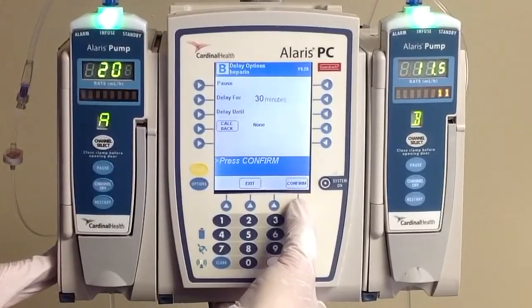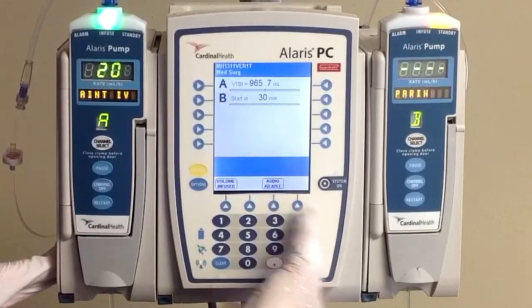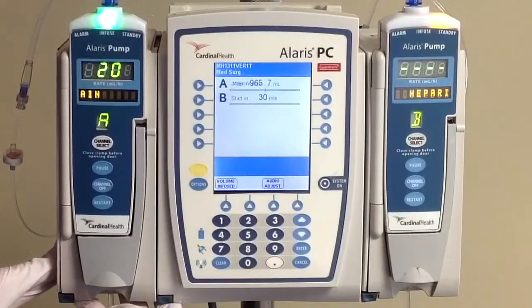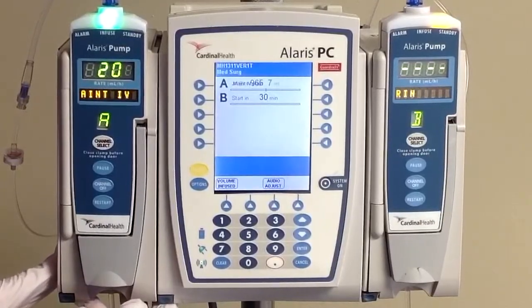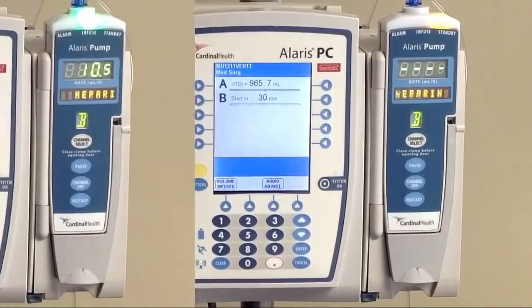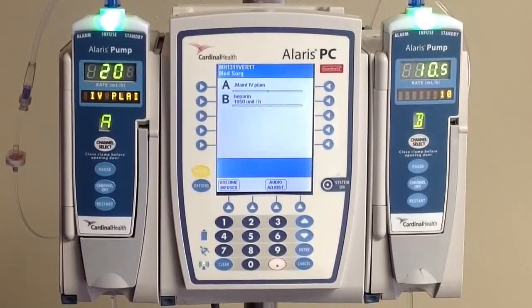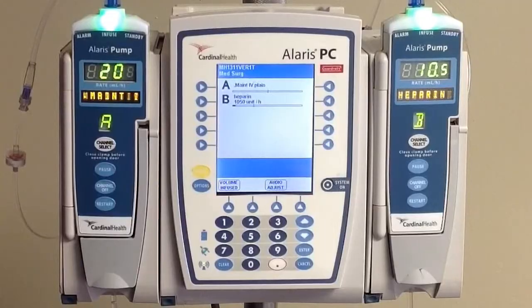You're going to notice that your pump is now going to show that it's on hold — it's on standby with the yellow light in the lighthouse, and it's going to restart in 30 minutes. Once the delay is done, we have automatically gone back over to our 10.5 mLs per hour.